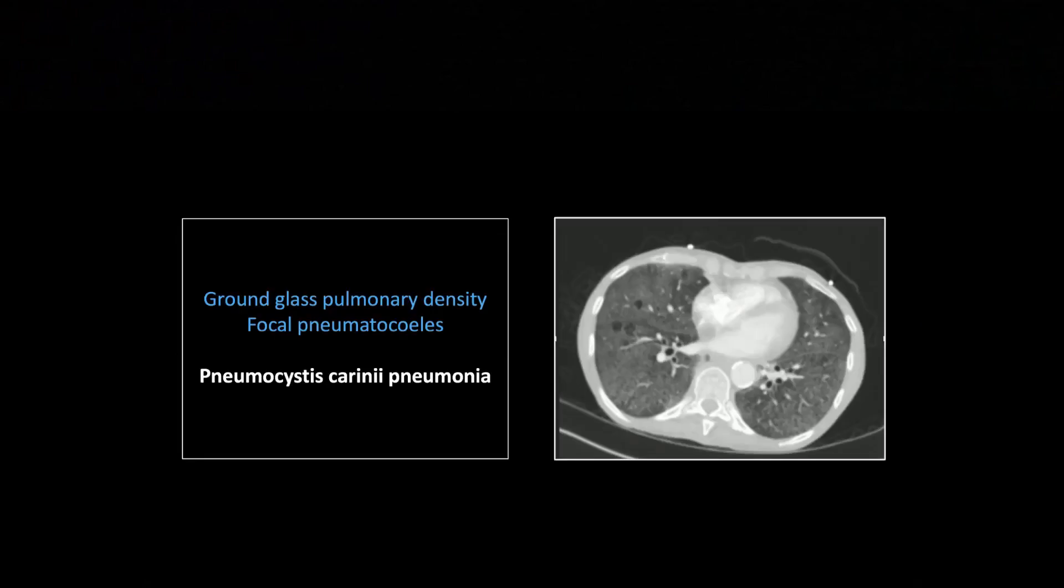This is extreme ground glass. It's everywhere. Beware in radiology, when you have a finding that involves all of a visualized structure, sometimes it can be a real fooler. There's ground glass density through all of the visualized lungs. That could actually fool you into just thinking it's normal if you didn't look closely enough. The one thing that would save you here is that there are these cystic regions. Those pneumatoceles are a classic finding in pneumocystis carinii pneumonia.